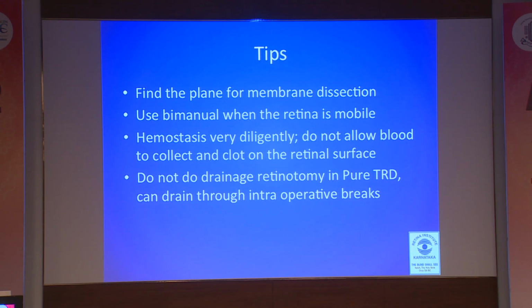As a rule, I don't do a drainage retinotomy in a pure TRD. It's not necessary. If you relieve all the traction and leave the eye, the retina settles down without the need for any SRF drainage. But if there are any breaks that happen during surgery, or in a combined retinal detachment, it is better to drain the SRF.